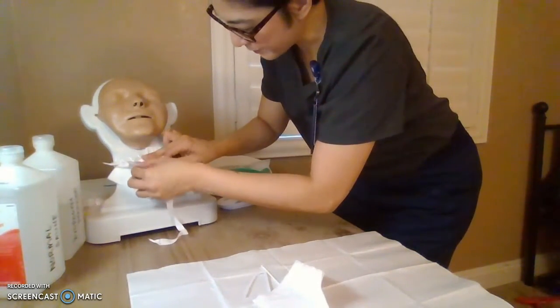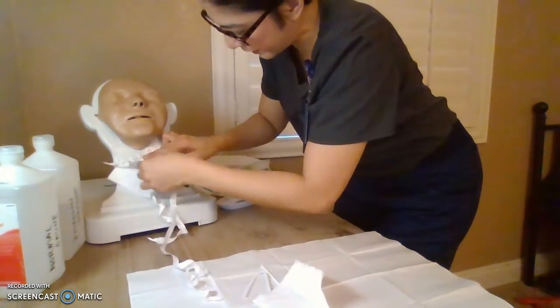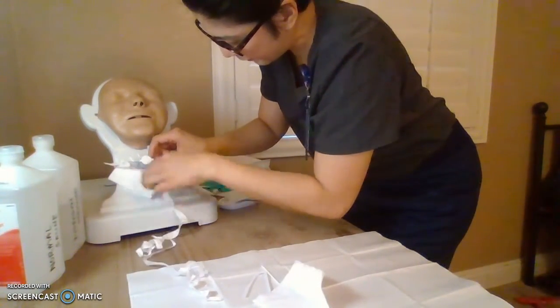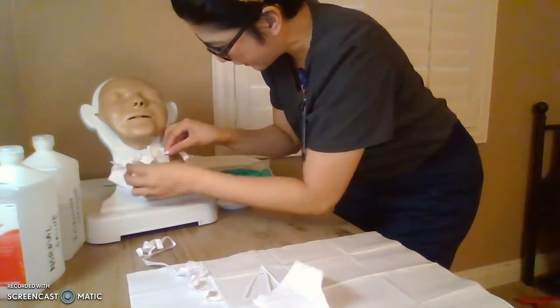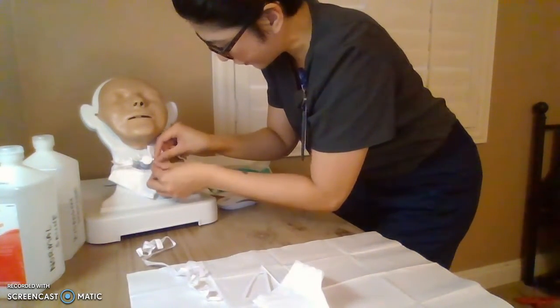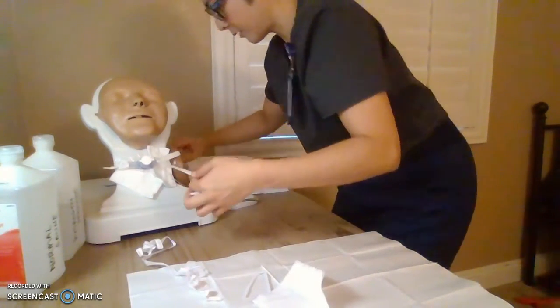Now we're going to remove this part. You're reinforcing, remember? Okay, make sure it is stable. Remove that part or have this in first before you remove it. Okay, since you're working alone. So now you're going to thread that in. All right.